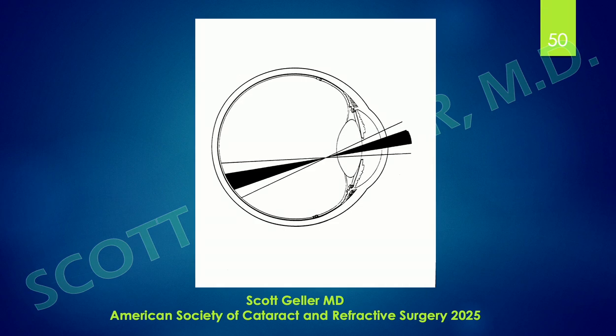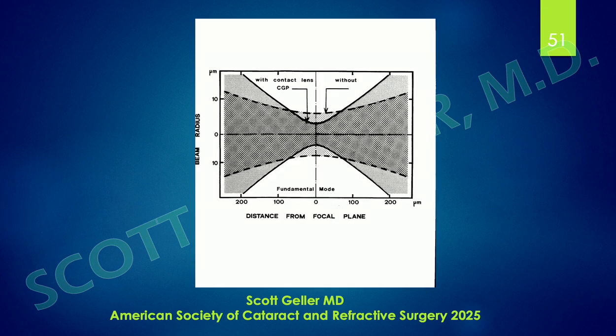So the same power going in is much more dangerous without a contact glass than it is with a contact glass. We've gone over this again. If you look at the diameter with a contact glass, you can see that the irradiance is much reduced. And without the contact glass, the irradiance is actually increased and more dangerous.